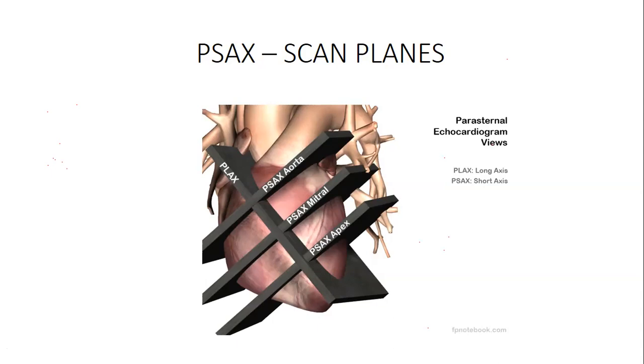When the patient is in this position, you are having that kind of longitudinal section, and that must be understood. And how you understand that point is to ensure that the part which is closer to the chest cavity must also be understood.